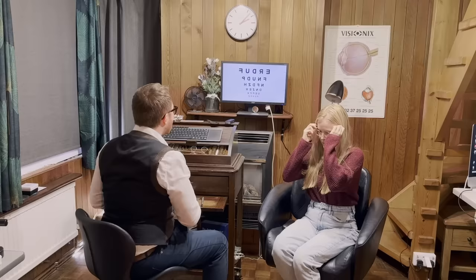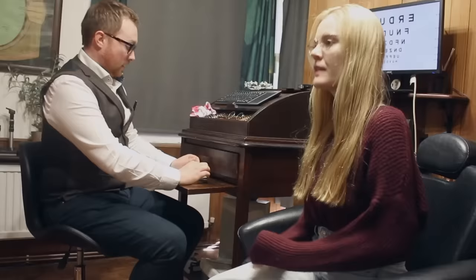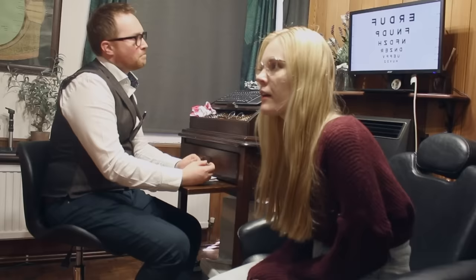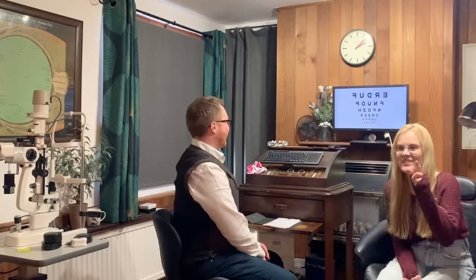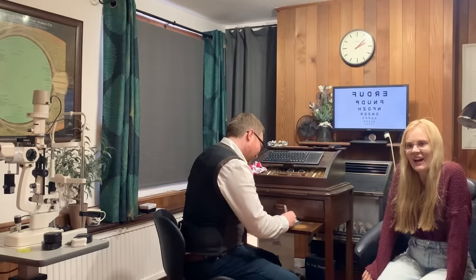Right, so having a look at the mirror just down there for me. We're going to have a look at some of the letters on the screen. At the moment, what would you say is the smallest line that you can read? With these on, I think I can see the bottom line. Okay, yeah. Do you want to have a go at that one? H. Yep. Very good. The next one was a V. Yep. And D and Z. Brilliant. That's good. If I was really cruel and added an extra line, could we get anything on that one there? It's absolutely fine if not, don't worry. I could do the start, I think. Okay. D, H, yep. Z.